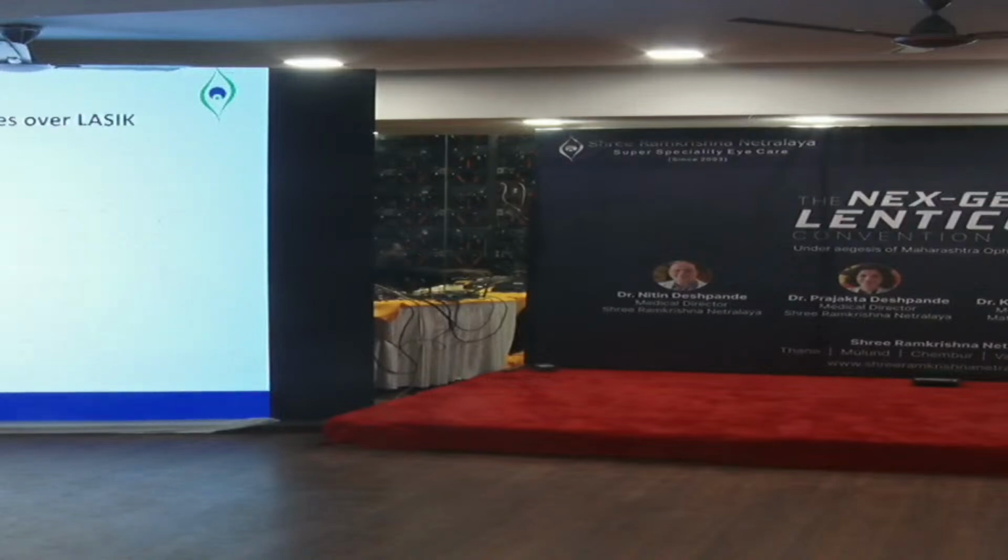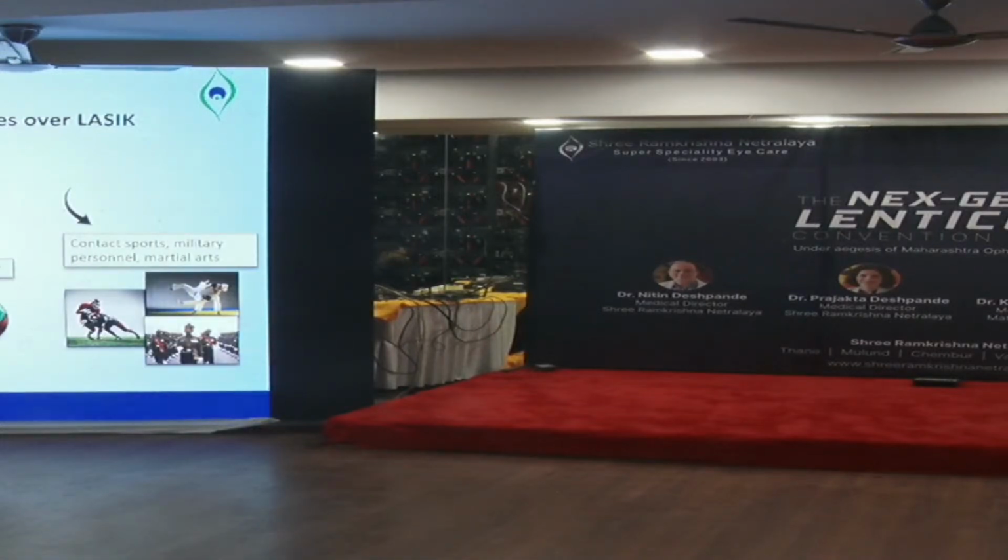So where SMILE holds upper hand over LASIK are cases where there is mild ocular surface disease, as in SMILE, we usually do not tend to hamper the subbasal nerve plexus much. High refractive errors, and I mentioned before, contact sports, military personnel, and martial arts.